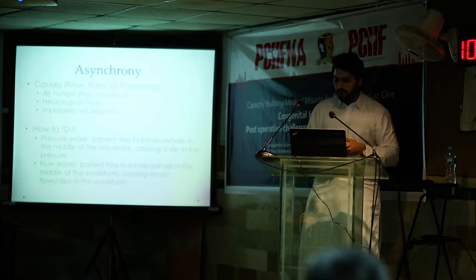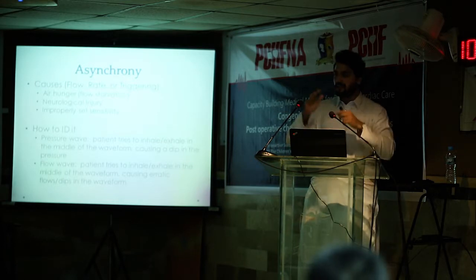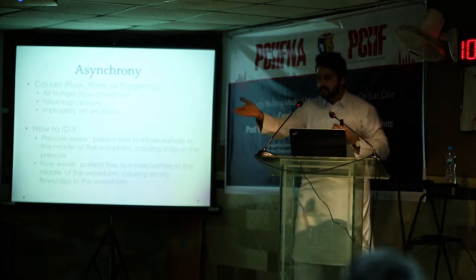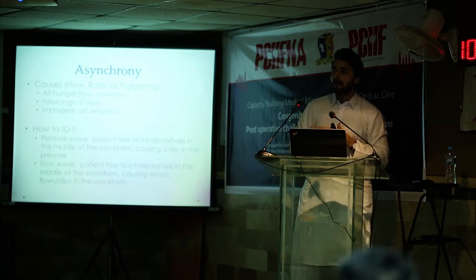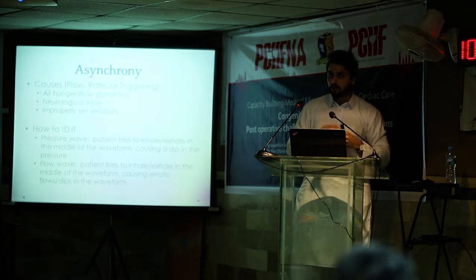Pressure waveform. It will be very obvious on the ventilator. It will not be smooth; there is usually a breath above a breath. And you can see it on the patient, if he has air hunger. So the solution for that, for example, you can ask the doctor to increase the sedation in cases like central or neurological.